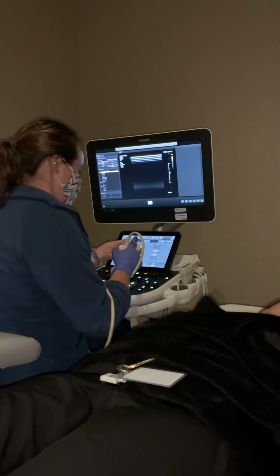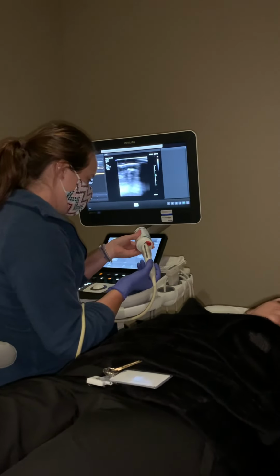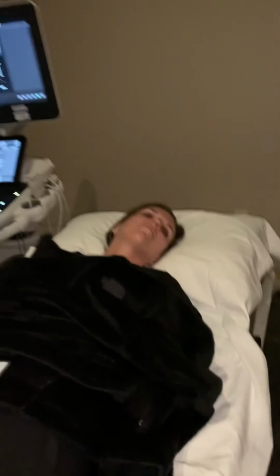All right, this is your carotid demonstration. Okay.